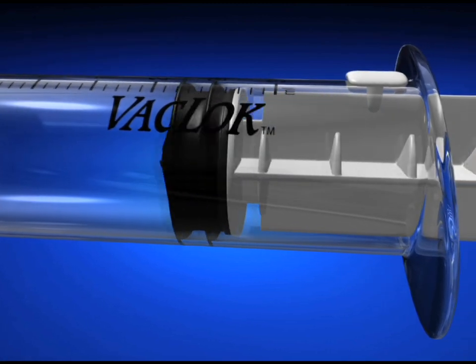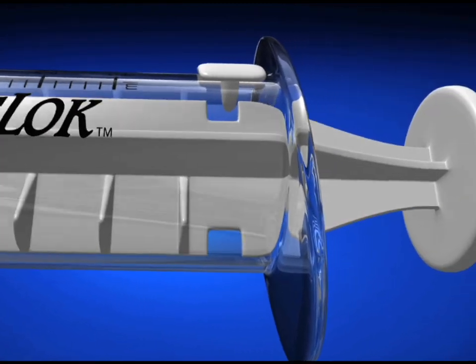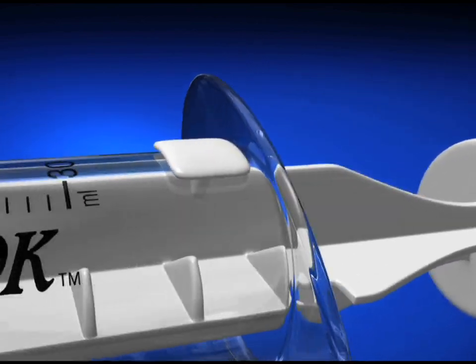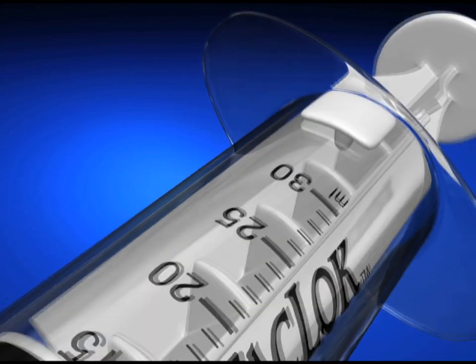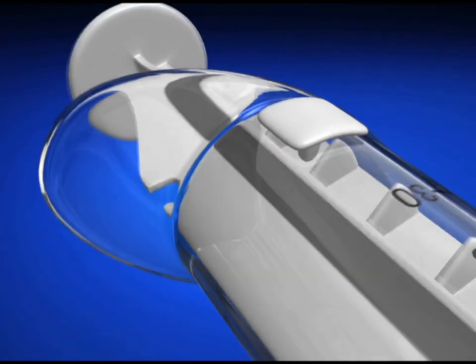The Vac Lock Syringe incorporates a transparent polycarbonate barrel which provides clear visibility and a smooth-as-glass look and feel.